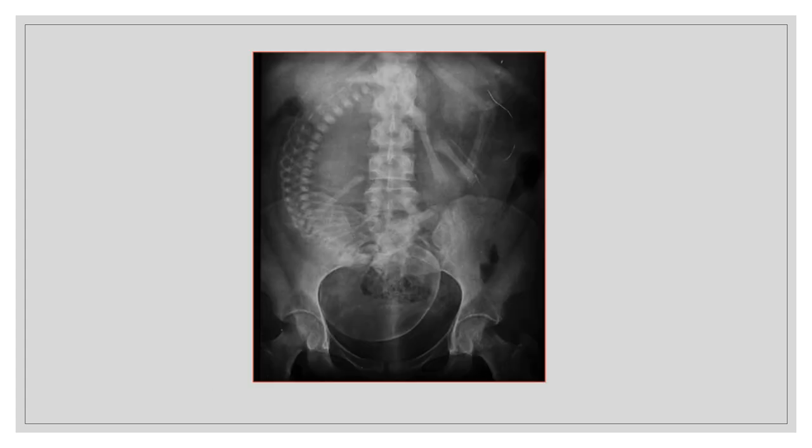What type of artifact? Internal slash anatomical. Do you see the baby that is upside down in the pelvis? You see the head near the pelvic ring and the spine coming up the right side there with the legs going across the belly.